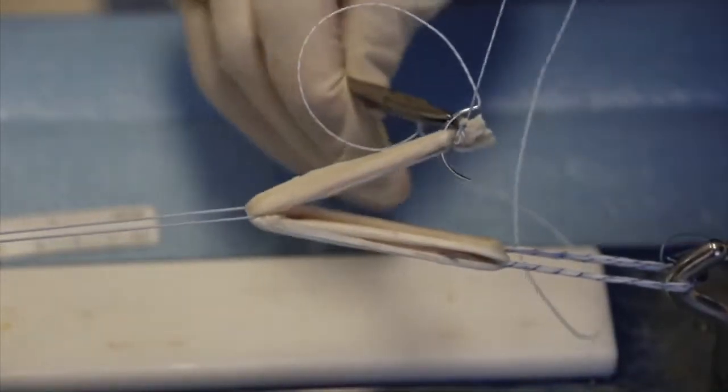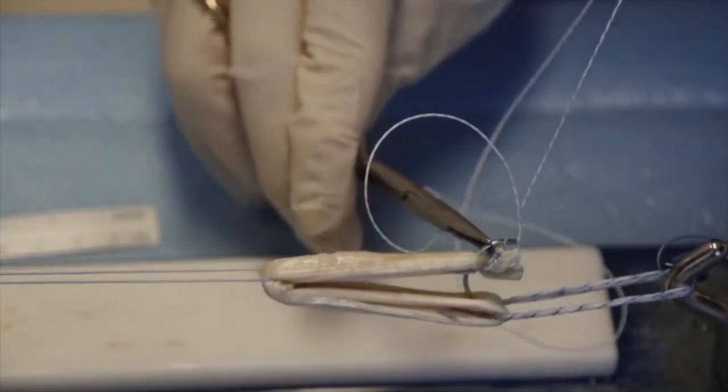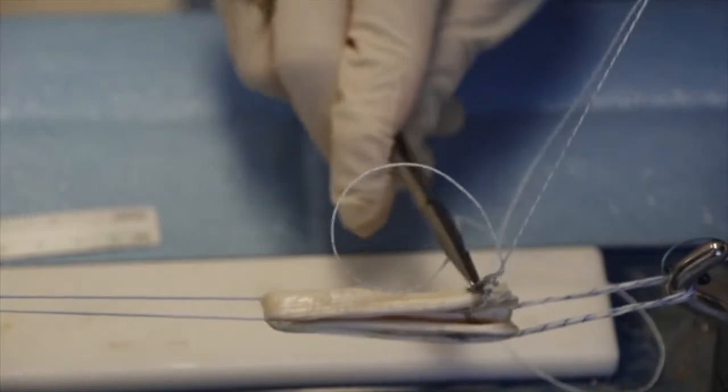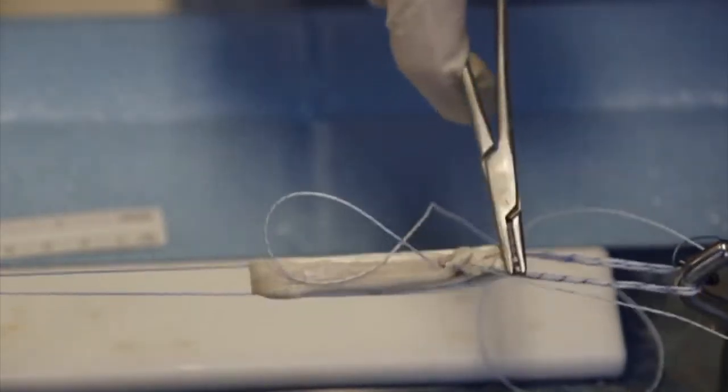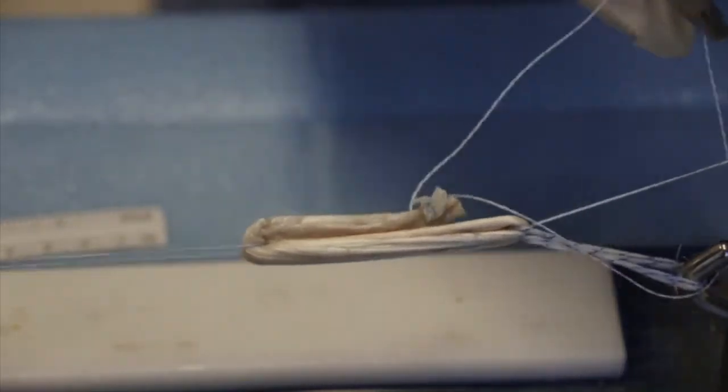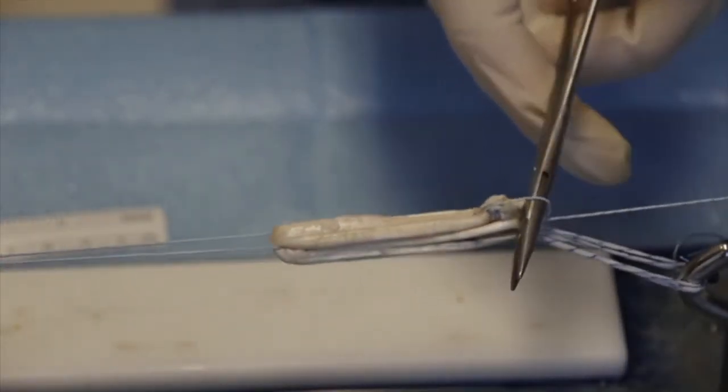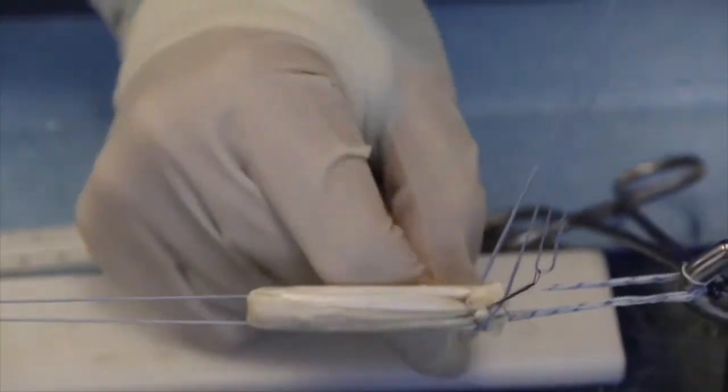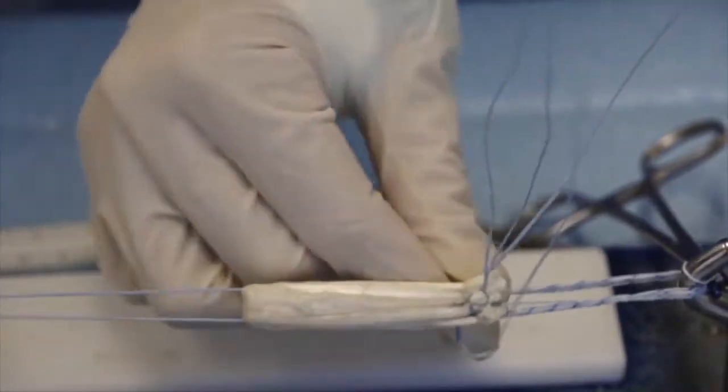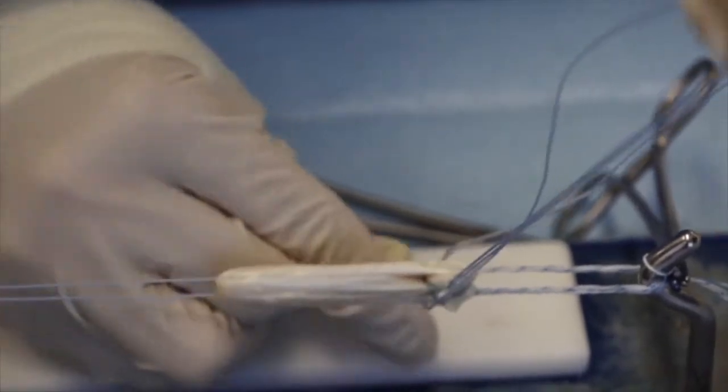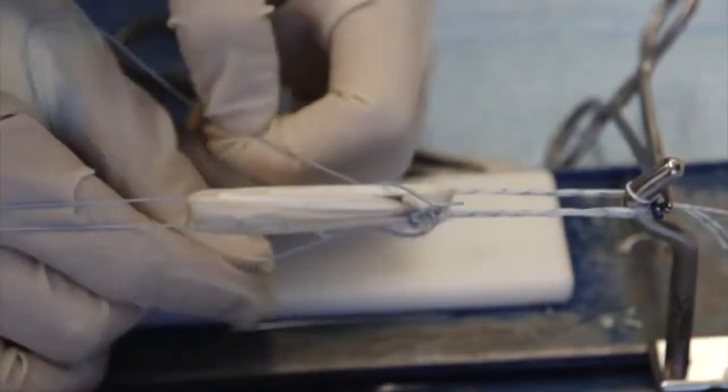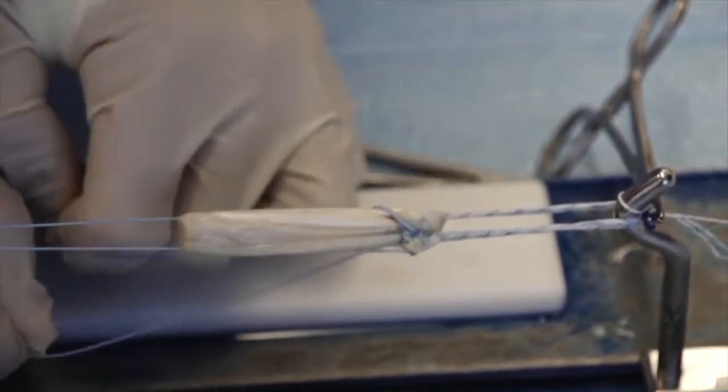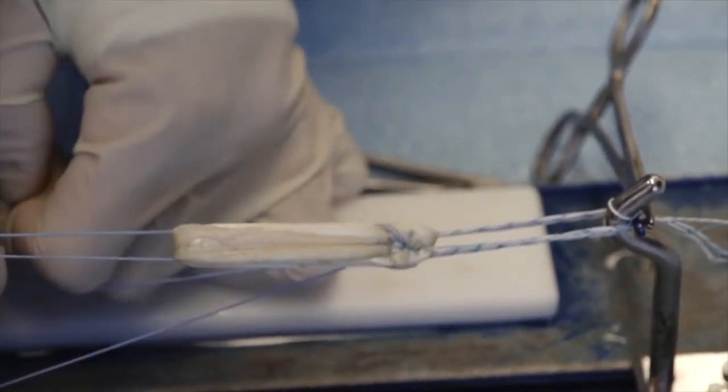The needle is passed through the proximal part of the graft stump, grabbing and tensioning the distal part with a non-absorbable suture. The four strand graft is then whip stitched with fiber loop from proximal to distal.